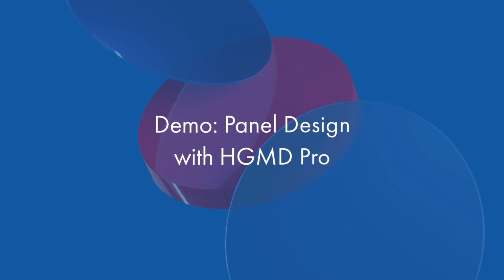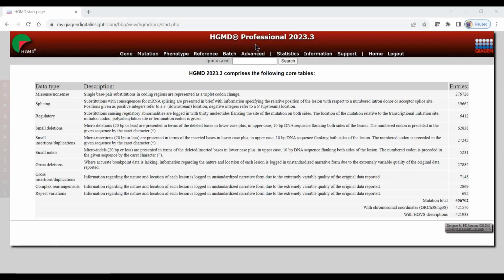So let's dig in. In this next portion of the video, we'll demonstrate exactly how you can use HGMD Pro to design the best possible cutting-edge germline panels. All right, so let's get started. One way to use HGMD Professional for panel design is to look at the genes that are associated with your phenotype of interest.